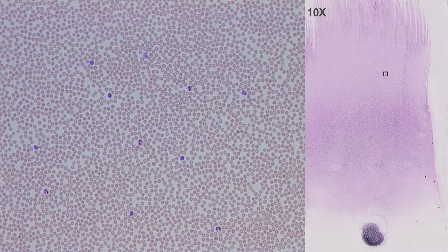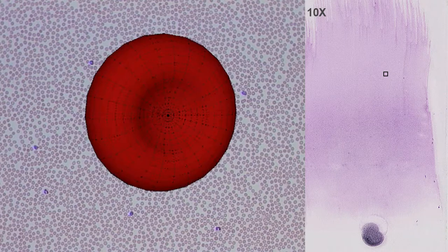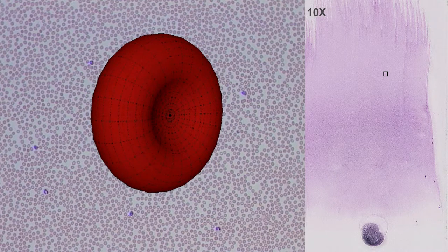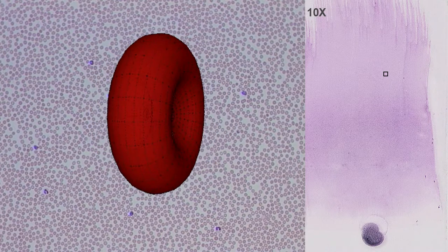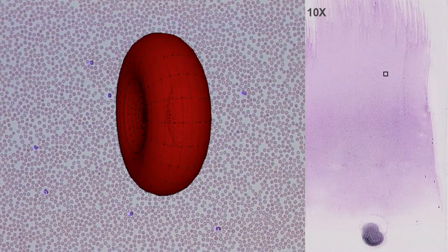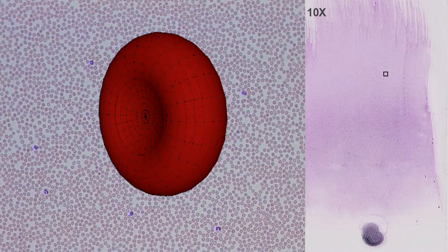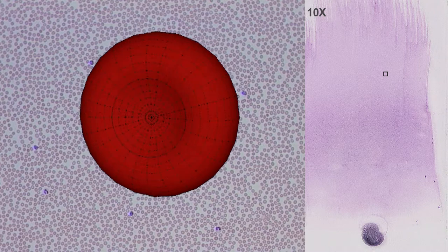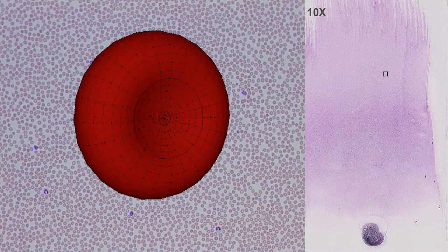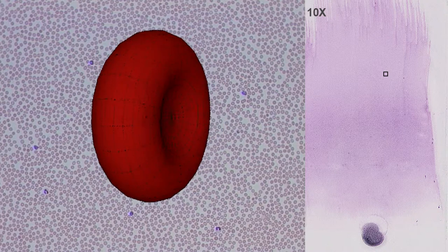As you would expect, the most abundant cell type is the erythrocyte, representing 99% of the blood cells. They are flexible biconcave discs and lack a cell nucleus. That shape is the one that causes a clear halo at the center of the cell when the light of the microscope passes through it.